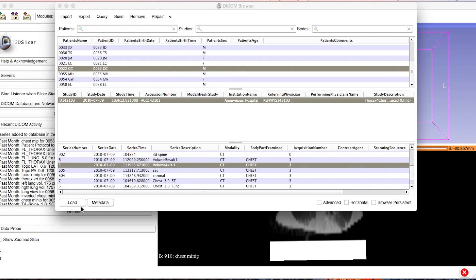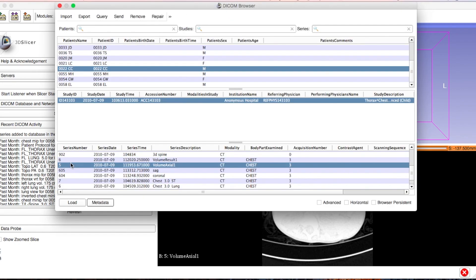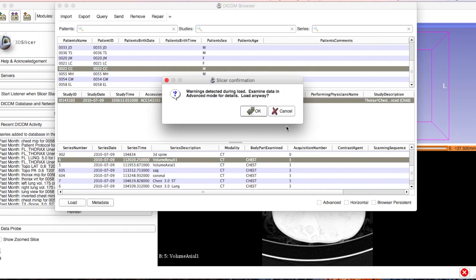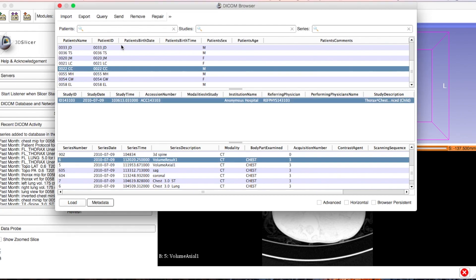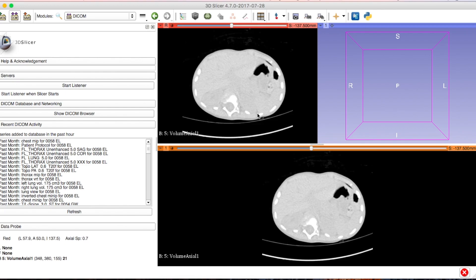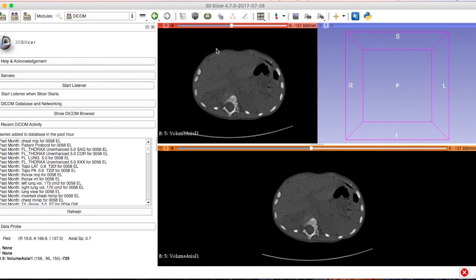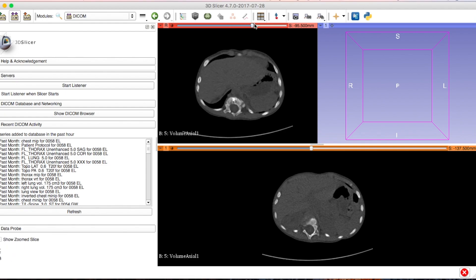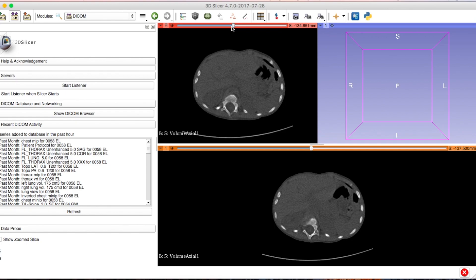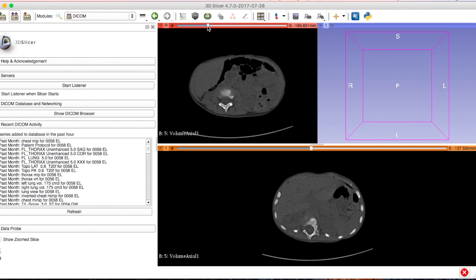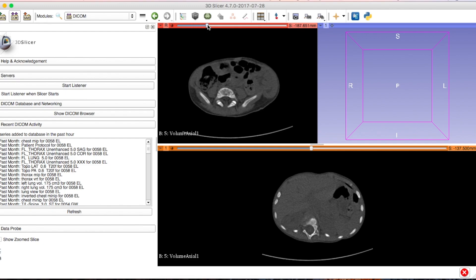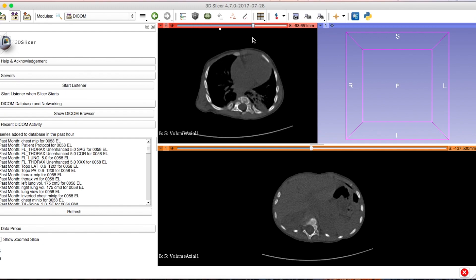It's loading — we'll try it again. Go to Load Six, and there's an error there — anytime you see that, always cancel out of it. Do not open it because it will shut down your program. I'm clicking and moving my mouse up or down to change the color contrast so I can see the bones. Going through the scan, nothing looks too blurry, so this looks like a good scan and I'm going to use it.